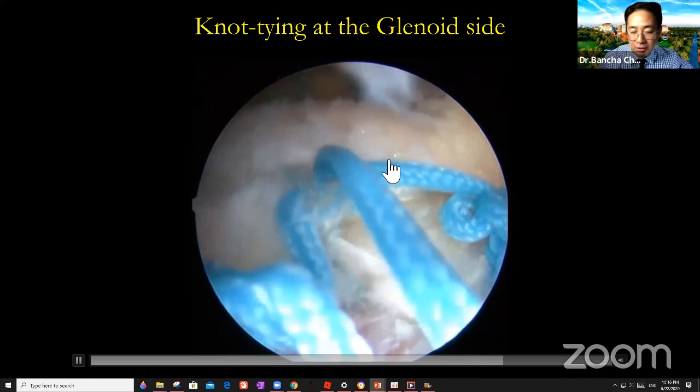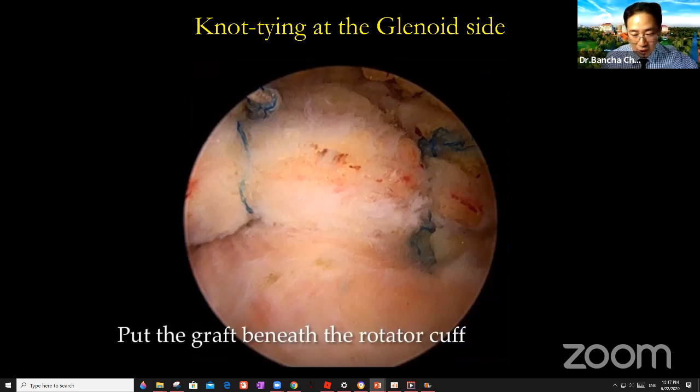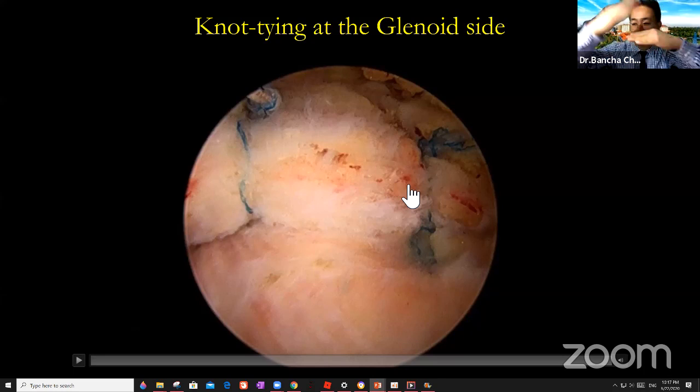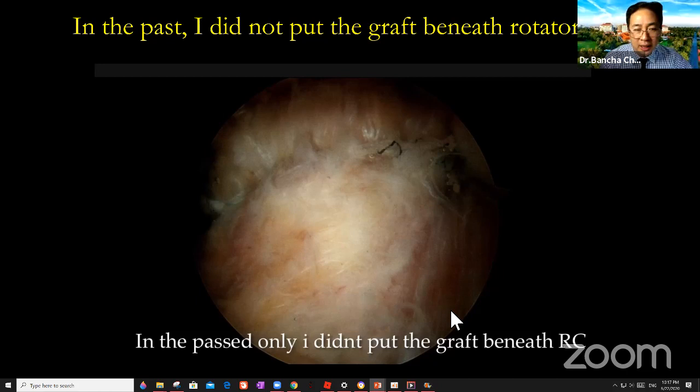And then you can have the two surface healing. The graft can heal on the glenoid and also can heal to the cuff, okay? So you can have this picture. See, this is a graft and the rotator cuff will cover the graft again, okay? Like this way. Because in the past, I had some patients that had problems of healing on the glenoid side, but on the tuberosity we have no problem, right? So in the past I did not put the graft underneath the rotator cuff, okay? And we have some patients that have delayed healing, no healing to the glenoid, okay?